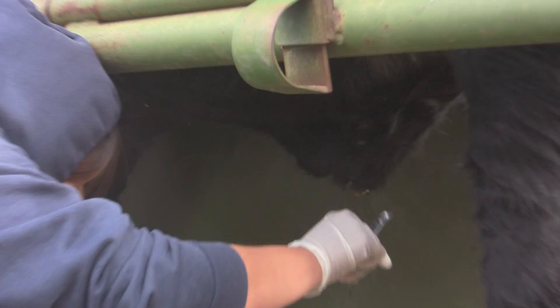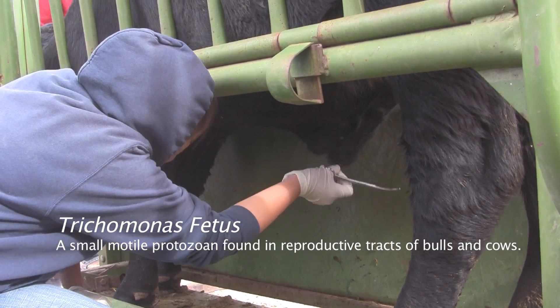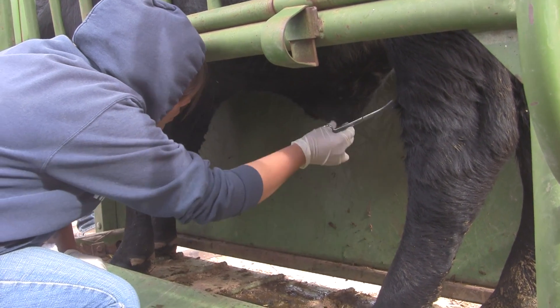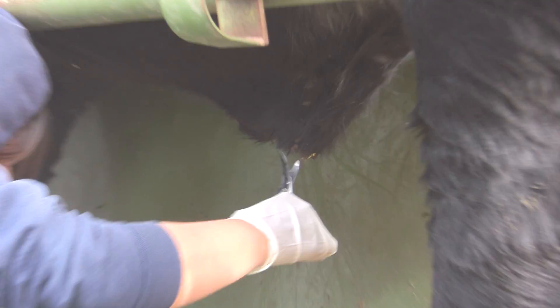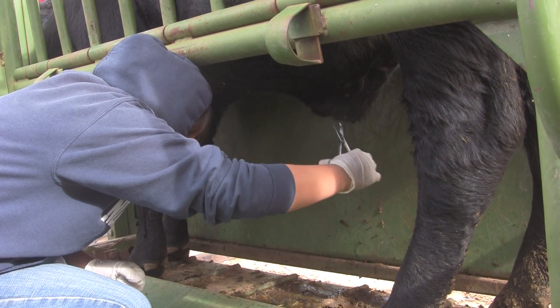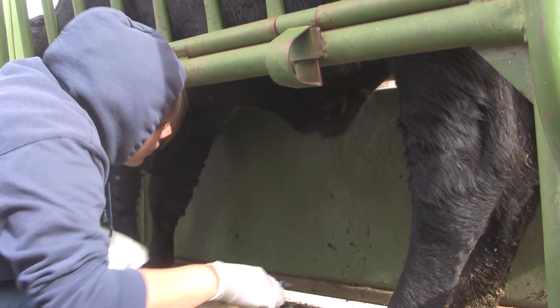This is a trick test. We're trying to detect or not detect Trichomonas fetus, which is the protozoan that will infect a bull's sheath. We're really big on cleanliness during this process. What we have going on now is we're trimming the excess hair from around the sheath, so we'll have clean entry of the pipette to avoid cross-contamination. After every bull, we change our gloves, also to avoid cross-contamination.